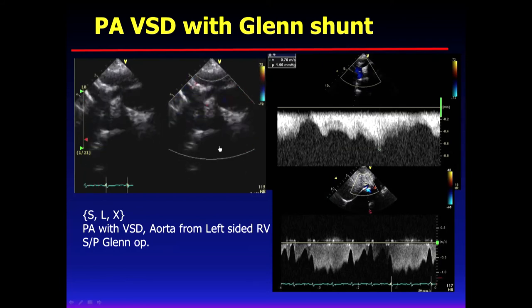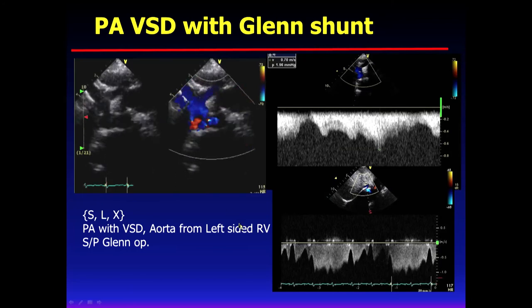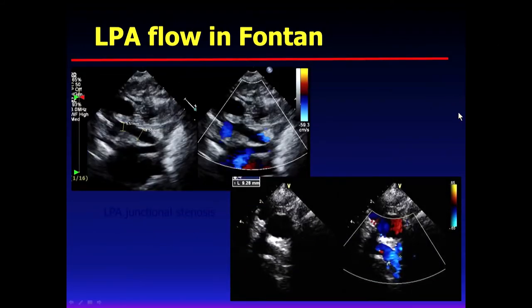So Glenn shunt and Glenn physiology, we can look at whether the SVC drains into the pulmonary artery well or not with color Doppler. This kind of Doppler velocity tells us the flow is okay. And then for single ventricle Fontan physiology, we decided to go. And after Fontan, pulmonary artery flow is very important.